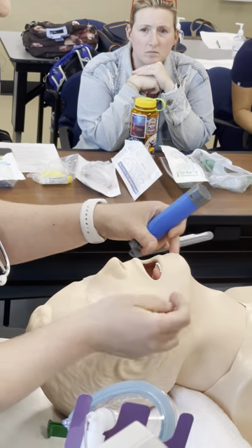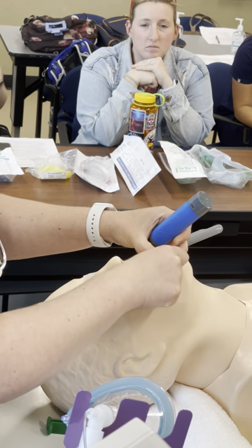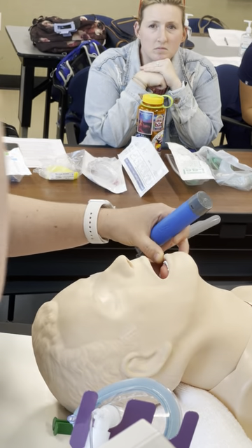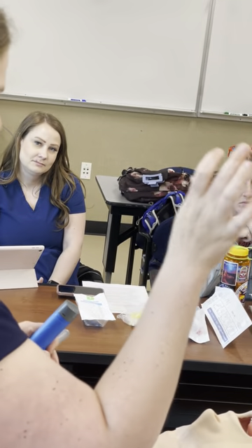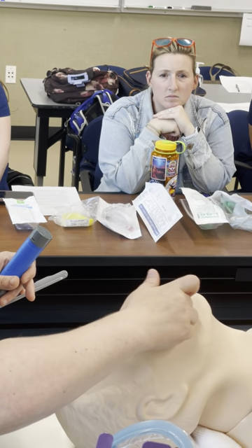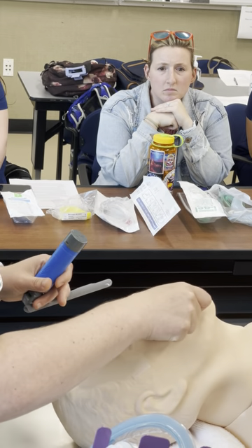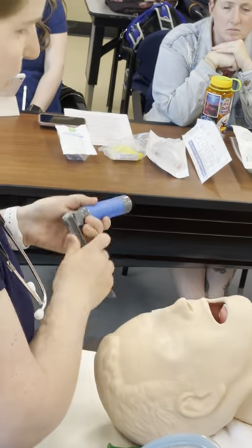When going to intubate after mask ventilation, start with a scissor grip: middle finger and thumb, with your thumb on the mandible and middle finger on the upper jaw. Push the mandible down with your thumb to open up the space for your blade to go in.